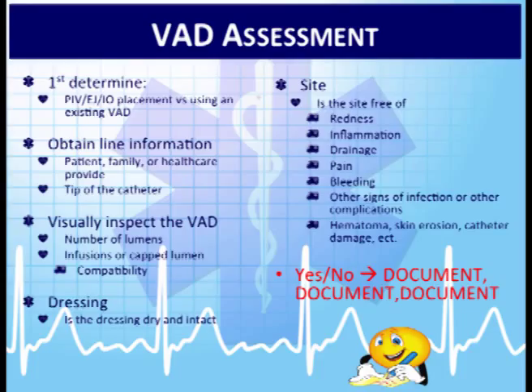Because compatibility is a huge thing, and we don't think about that all the time until you're en route to the next facility and the patient's status changes and we need to give a medication. We can't just go start infusing things in a line. What happens when you give pretty much anything with bicarbonate? What are you going to do? Not going to be compatible, right? You're going to have a problem with your line and possibly lose that line.